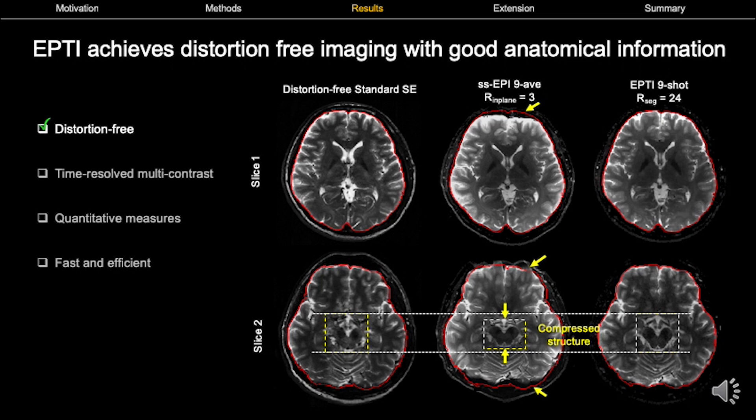Now let's look at some results. First, we evaluate the distortion levels. You're looking at distortion-free standard spin echo scan as the reference, single-shot EPI, and EPTI. We see that EPTI has accurate digital brain boundaries matching those extracted from the distortion-free reference scan, whereas single-shot EPI shows severe distortions with compressed structures.